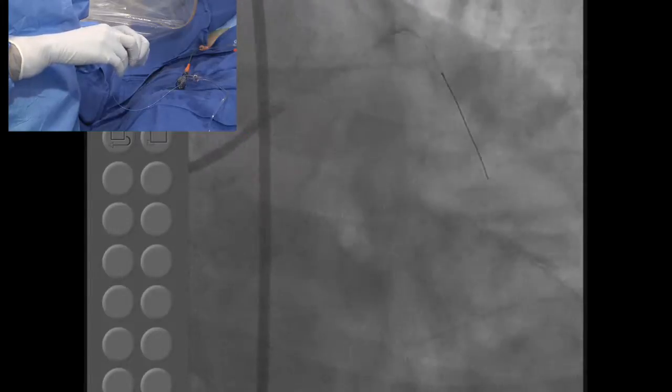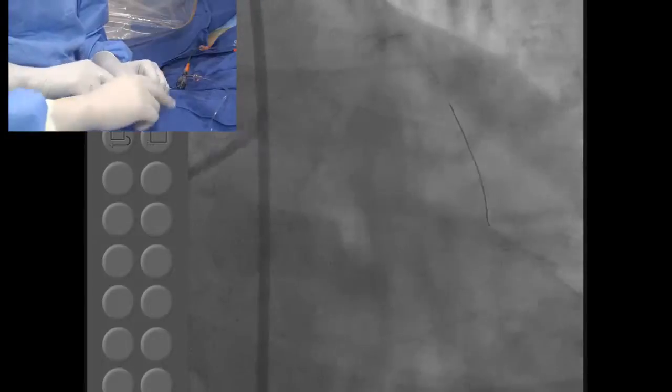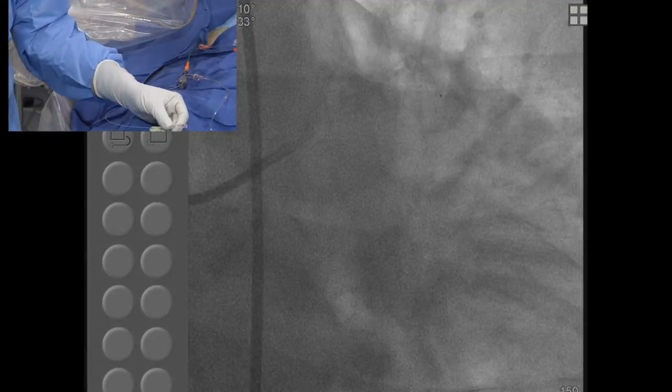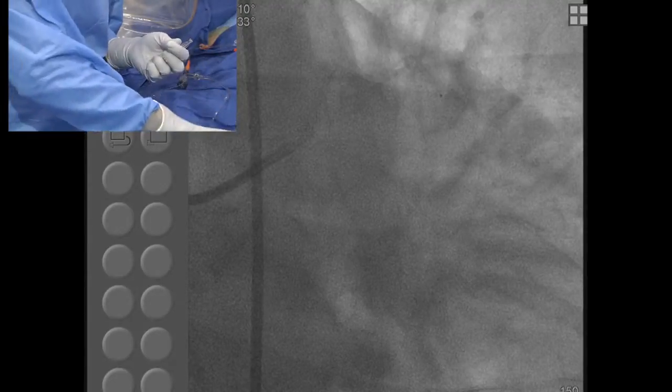The pictures definitely look very good. Yeah. You have to go with the confianza. Why did you take it out? Yeah, confianza. There, you are in the wrong place. You need to puncture again. That's the confianza in this view. We know exactly at 9 o'clock we need to go a little outside.